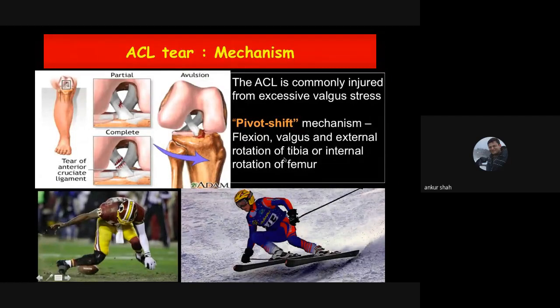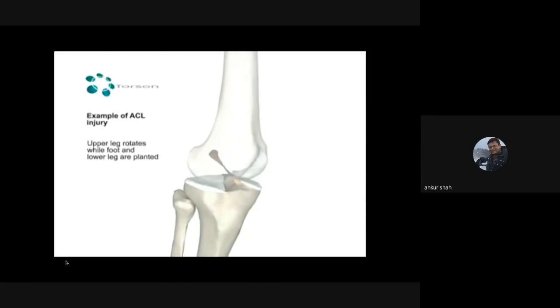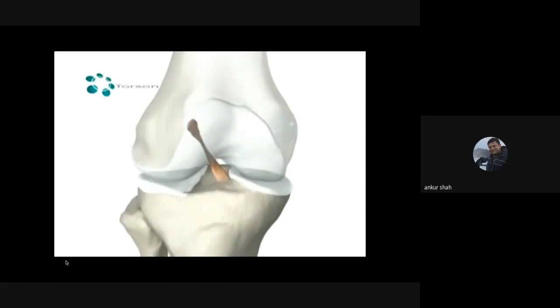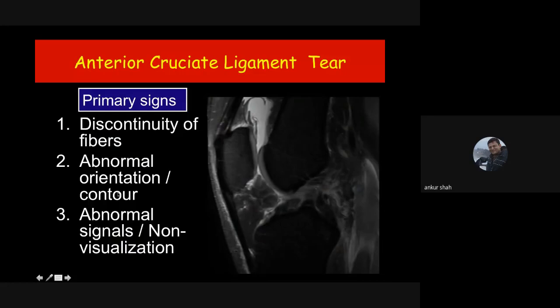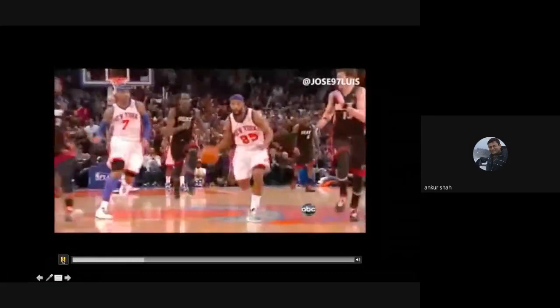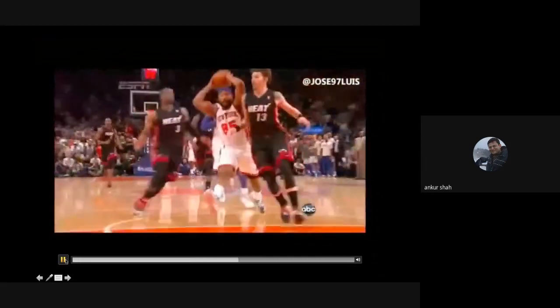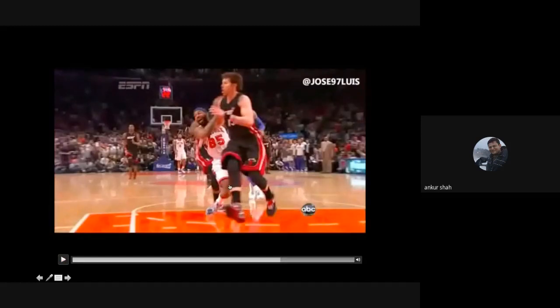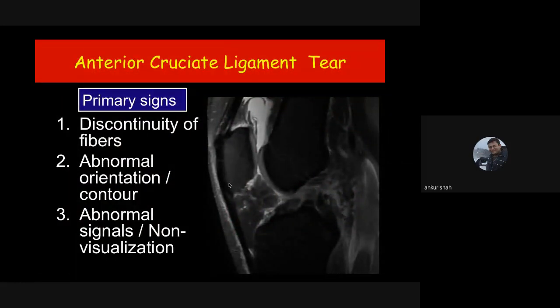For femoral attachment tears, rely most on the axial images. When you see the normal black signals of the ACL are lost and fibers are in discontinuity at the femoral attachment, this is the tear of the anterior cruciate ligament. The most common mechanism of ACL injury is the pivot shift mechanism — flexion, valgus, and external rotation of tibia or internal rotation of femur. When the leg is fixed and the femur rotates over the tibia with the knee partially flexed, the ACL gets torn.